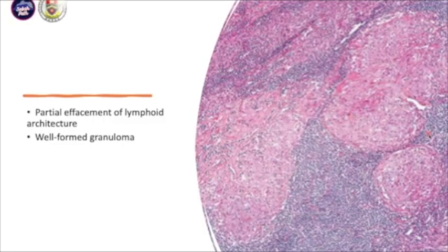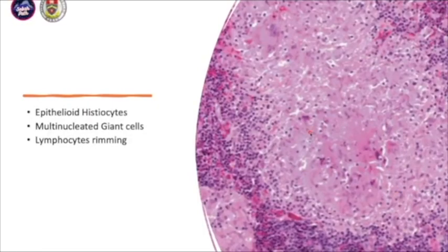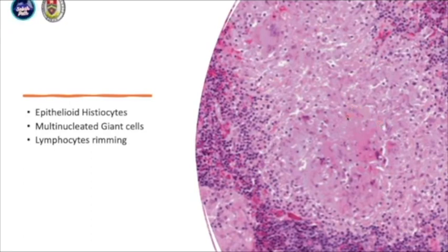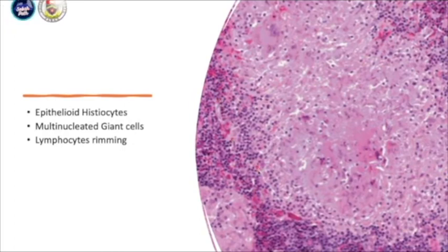What does this granuloma compose of? If you look at the higher magnification, it is composed of epithelioid histiocytes — histiocytes or macrophages within the tissue which have a pale nucleus and a shape like a slipper. And you have this multinucleated giant cell here. Within the granuloma, it is rimmed by mature lymphocytes. These are the characteristics of the granuloma.